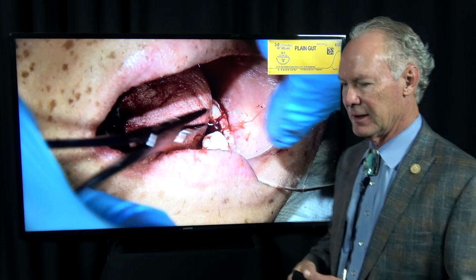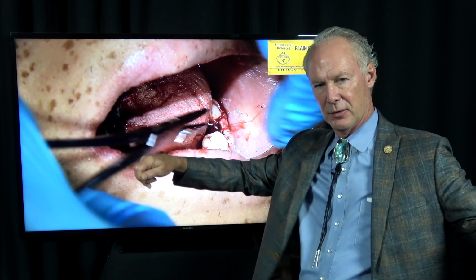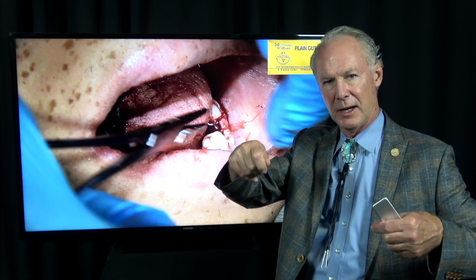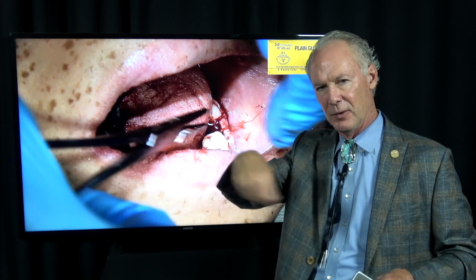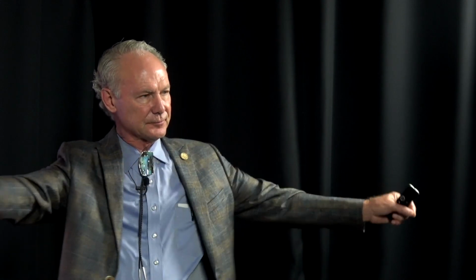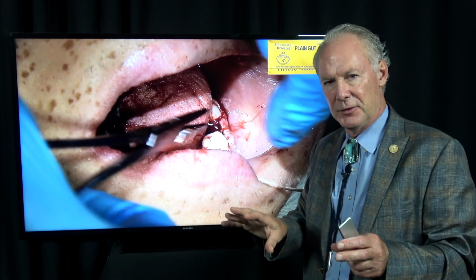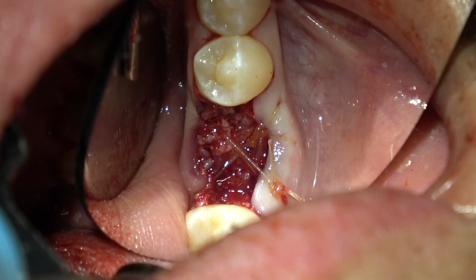Now here's the secret of suturing. You go 1, 2, 3 away from you, pull, then go 1 wrap towards you, pull, and then another one away from you, pull. Now if you go 1, 2, 3 away from you for the first pull, that will stay snug while you're doing the wrap towards you. If you just do 2 wraps, 1, 2, and pull, oftentimes that wrap will loosen a little bit before you get to the second single wrap towards you.